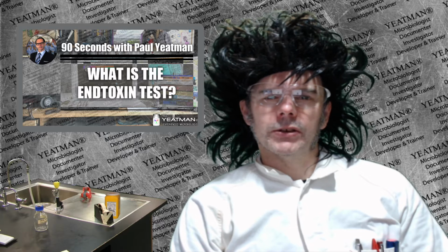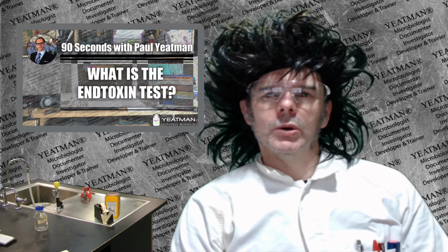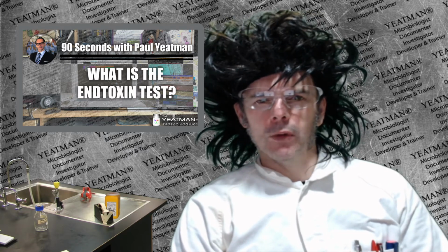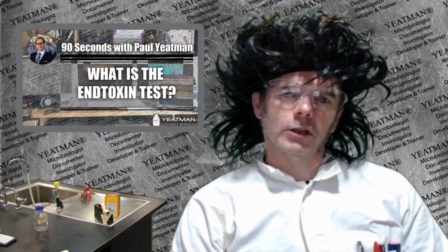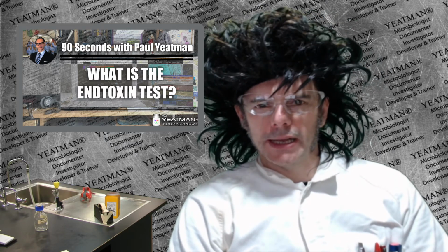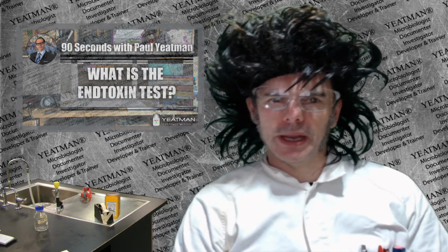There are a few different endotoxin tests. One test, the most popular one, is the LAL test, or Limulus amebocyte lysate test, and that uses the blue blood of horseshoe crabs and its clotting reaction to get a result. Other tests are chromogenic, that is a colour change, or turbidimetric, as in how cloudy the test sample gets.